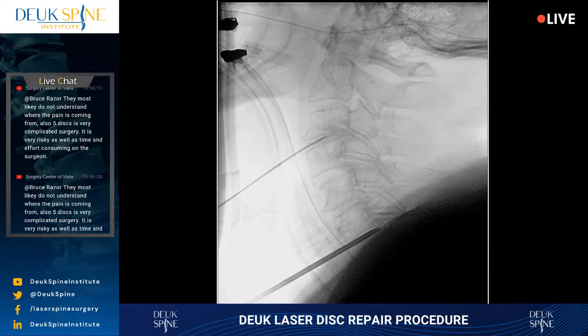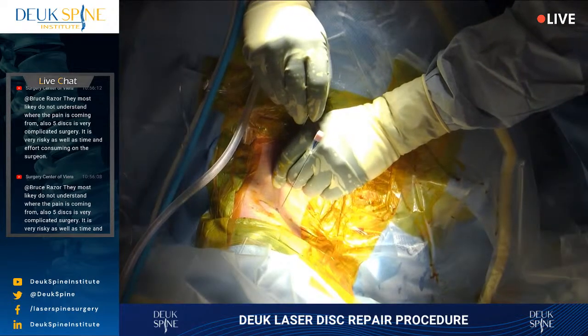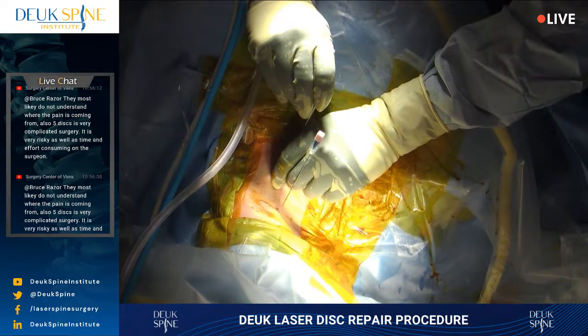Between the longus colli muscle bellies. I'm going to make sure I stay in the middle, and I'm going to make my way up to the next disc, which is 5-6. Are you ready? You can see we have a tiny incision, 4 millimeter. We had virtually no blood loss, and the whole surgery is done without cutting muscles or tissues, just the skin.